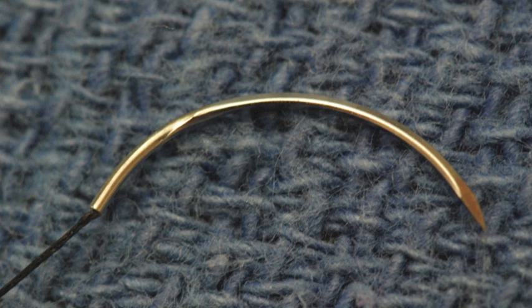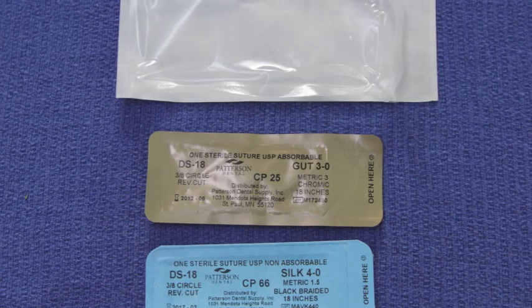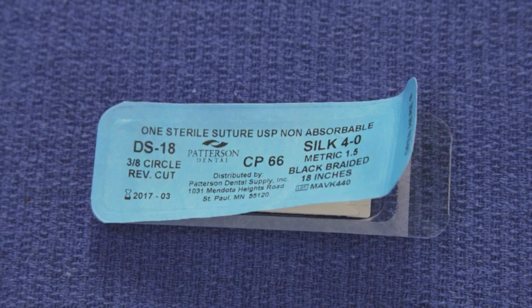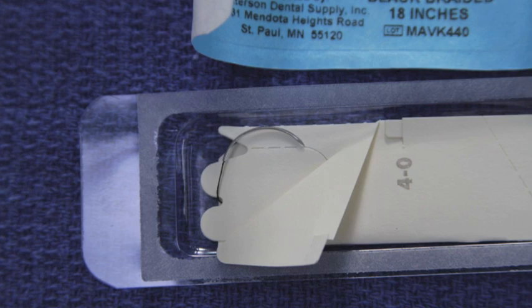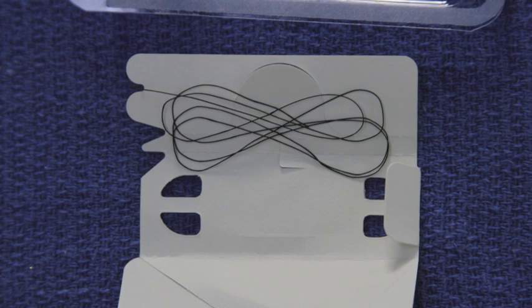As you can see in these images, the suture material is in fact in two packages: the outer package, which is used in general storage, and the inner package, which will be found at the surgical site. The inner package is completely sterile, and as it is opened, it should be opened in such a way as to protect the suture from contamination. As the cover is taken off, there will be a white under portion that actually holds the suture and the suture material. Peel back the corner and you can see the needle. This is going to be grasped with the needle forceps and gently removed, pulling out all of the suture material. Pull slowly so as not to cause knots as the material is being pulled out. The needle will be grasped by the needle holder and then passed over to the surgeon.